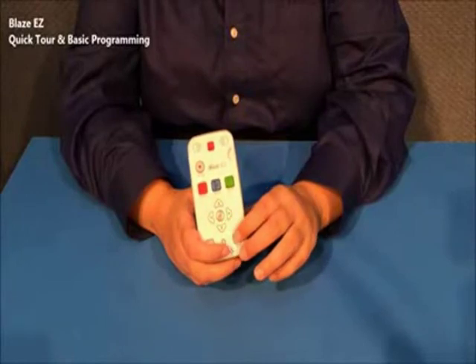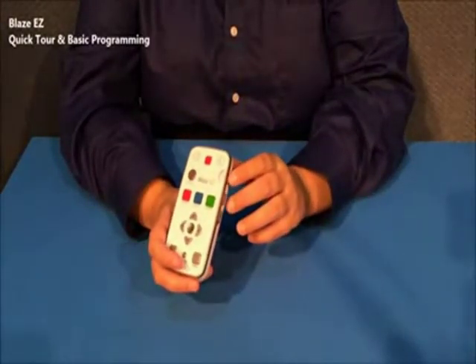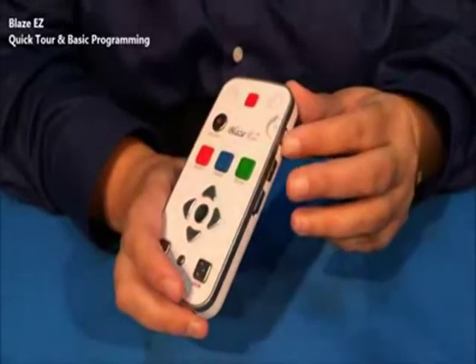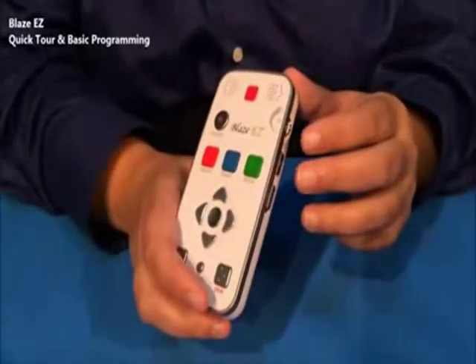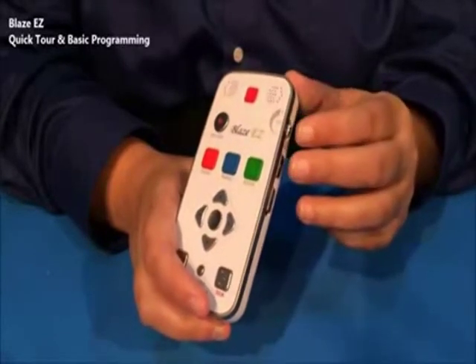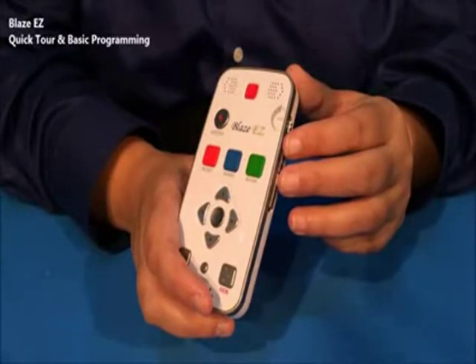So the last thing I want to show you in this video is a little bit about how to adjust volume and other settings like it. As I explained previously, you can simply move the dial. Volume 13. Volume 10. Volume 11. Volume 13. Volume 15. That will adjust the volume, and it goes to 15, and that little beep sound told you that I was at the highest setting.